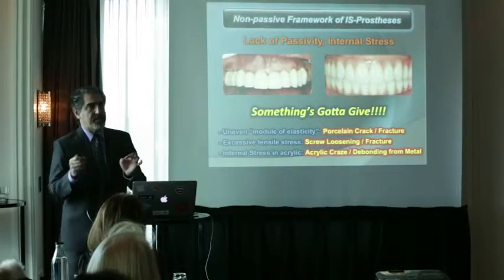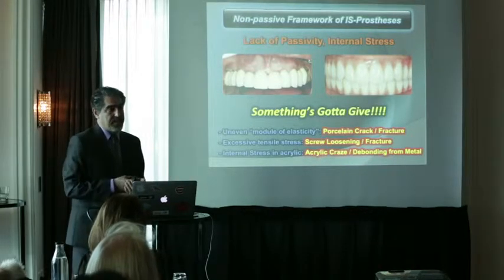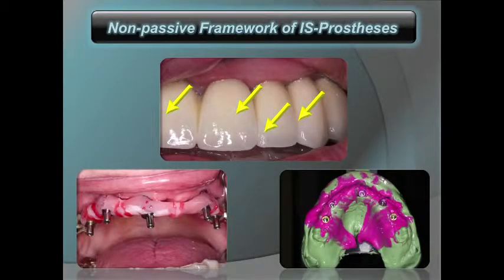So non-passive prosthesis can cause a wide range of prosthetic and biological complications. Here I want to show one of the cases that I did in IPU. The case was back. It was actually one of the residence cases. I inserted that. I felt that it's not passive. And this restoration was all porcelain metal. About 5 or 6 implants and then porcelain metal all the way.